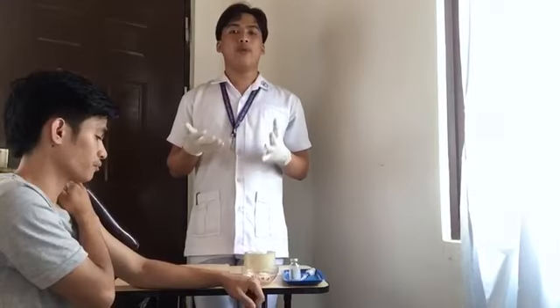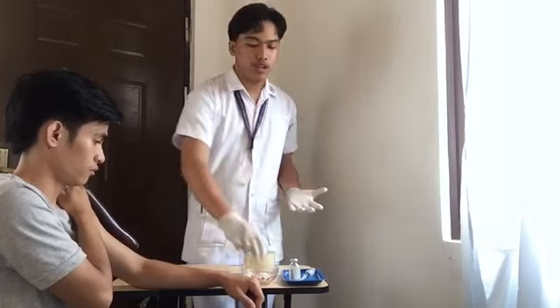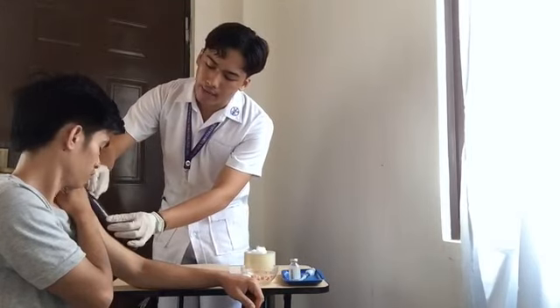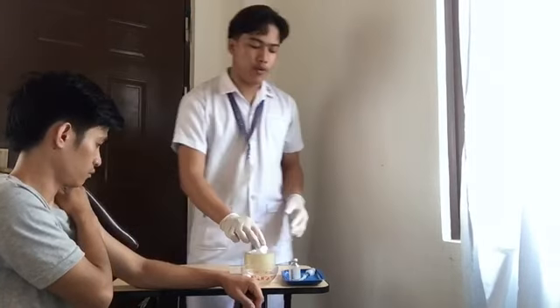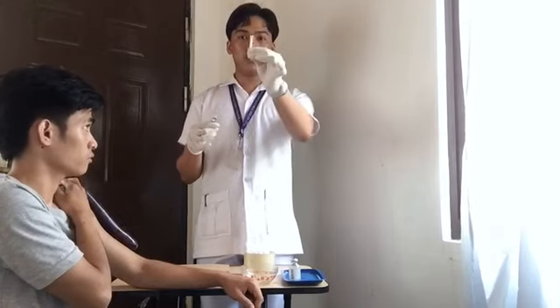Next is apply clean gloves. So I already wear my clean gloves. Next is clean the site with antiseptic swab using a circular motion. So I am going to clean the site in a circular motion. Okay, I am going to discard this. Next is prepare the syringe for injection. Remove the needle cover and discard it without contaminating the needle. So I am going to discard this.